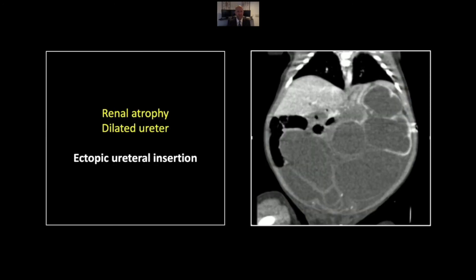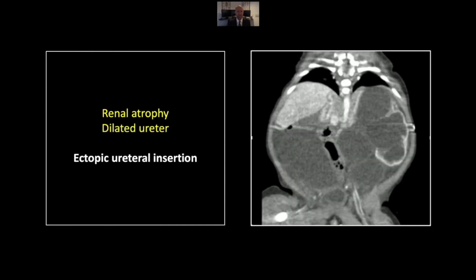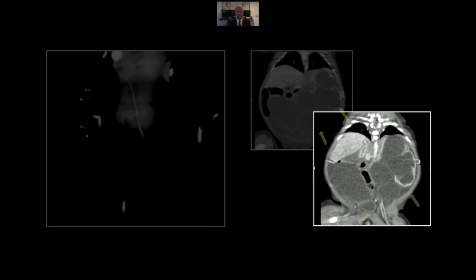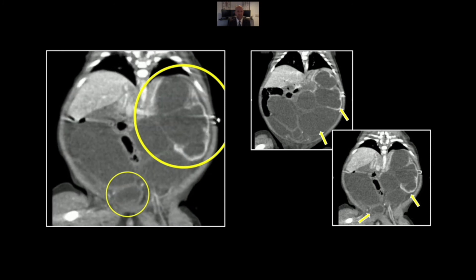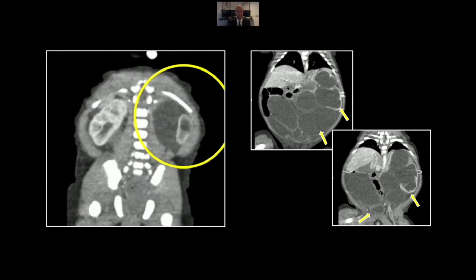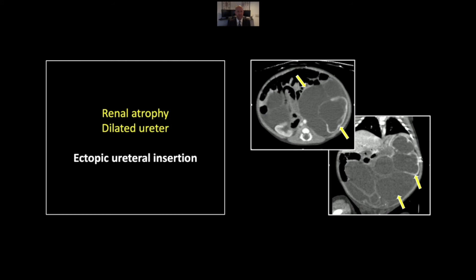I have this on a coronal as well, which really helps you appreciate the thinning of the cortex and the dilation of that ureter. And here is its ectopic insertion at the posterior aspect of the bladder. That is an ectopic ureteral insertion causing chronic obstruction and dramatic hydroureter and hydronephrosis.